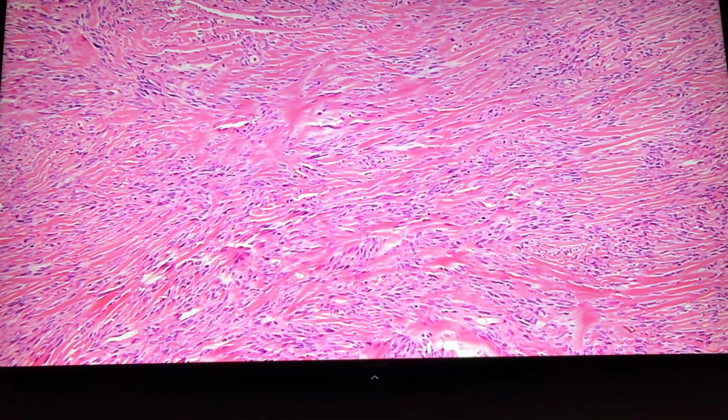Now, can somebody tell me how it looks? How does it present radiologically? Where do you find it inside the lung? Is it a nodule? Multiple nodules or single? Does it make a rind around the lung and surround it, or is it just one? Yeah, just one. It just sits on the lung like a seborrheic keratosis. It just pops out from the top of it. And they can be very big, but they are always on the surface.